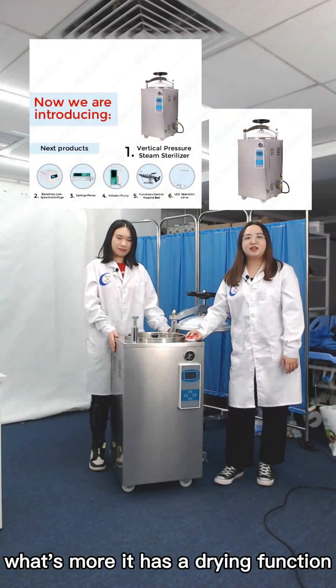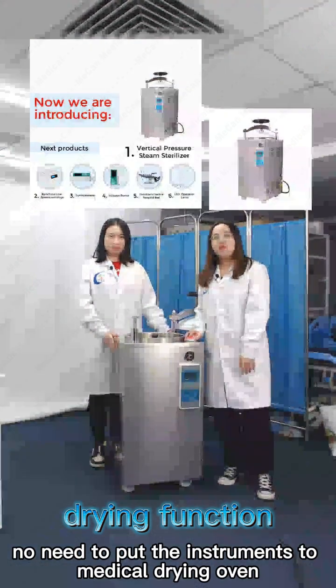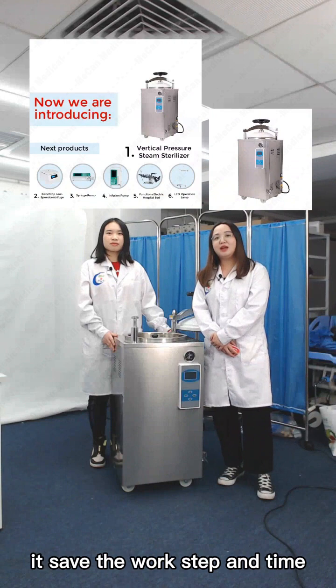What's more, it has a drying function. There is no need to put the instruments into a medical drying oven. It saves work steps and time.